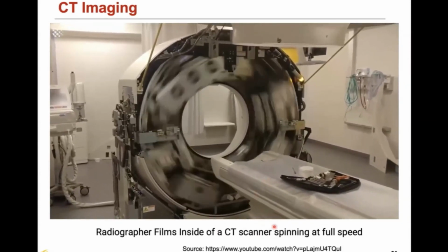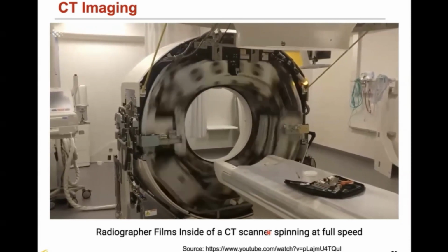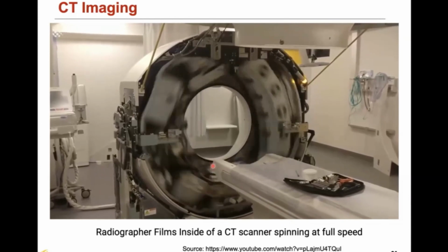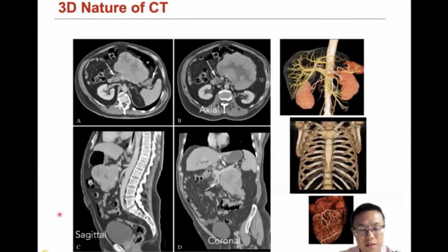So actually you can see the scanner can rotate very quickly. Okay, so I think you guys get an idea, right? How the internal mechanism of these CT scanners works.